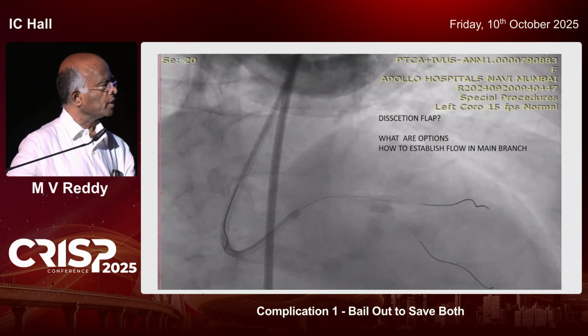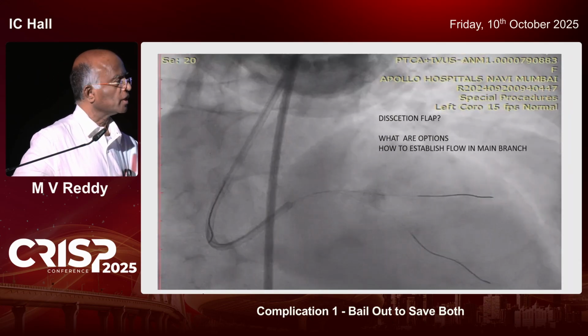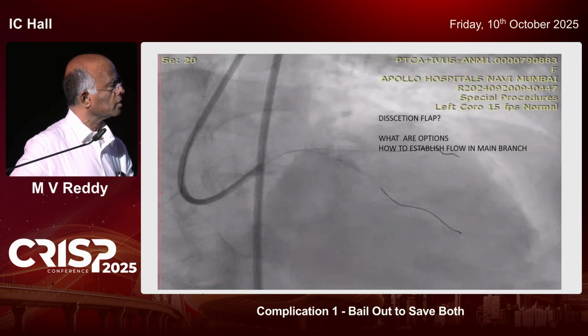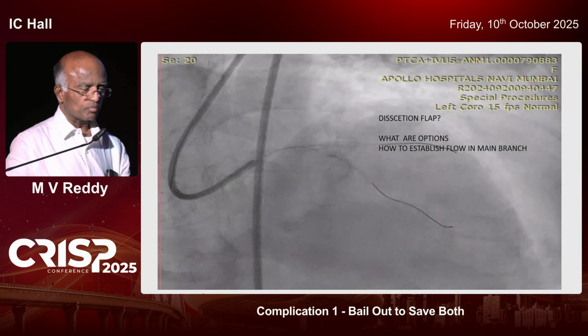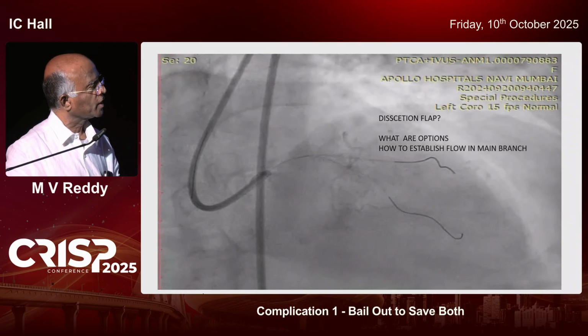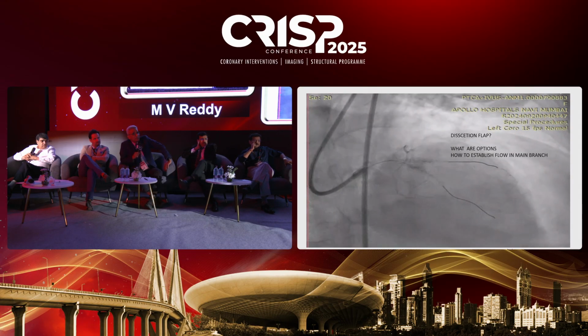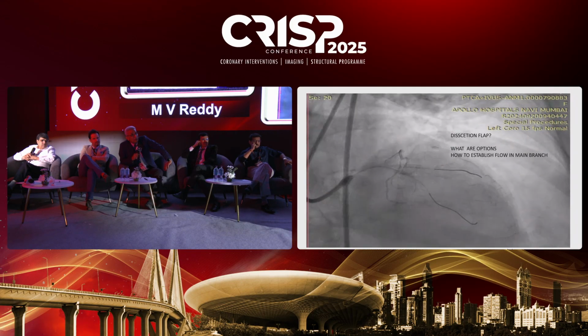We don't know. If a dissection is there, then you will aggravate it again. But this is just a carinal shift and stent, causing... No, there is a stent across the diagonal to the LAD. But that is the first step, you have to cross, no? Correct, but if there is a dissection flap closing the LAD, how do you go in to rewire? So actually, the jailed wire point. You cannot presume and assume until you try.